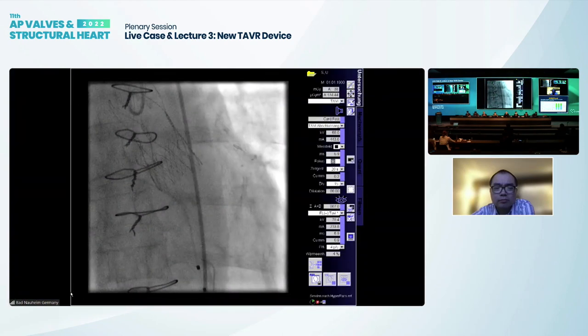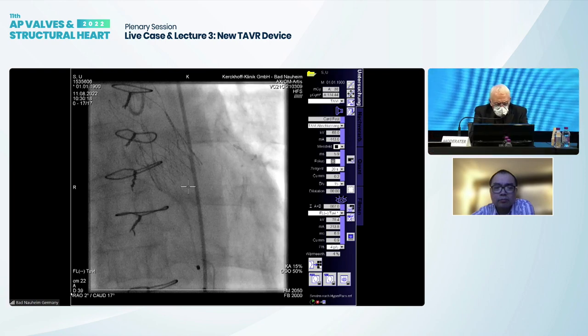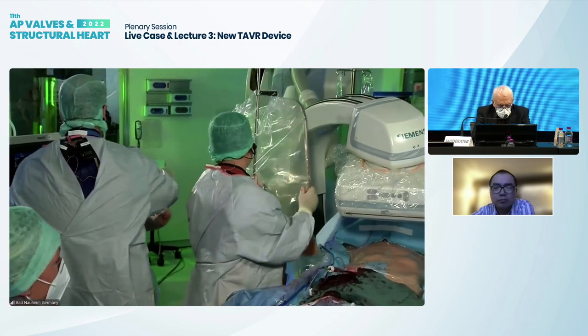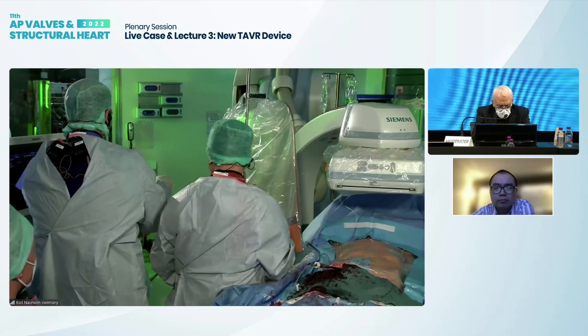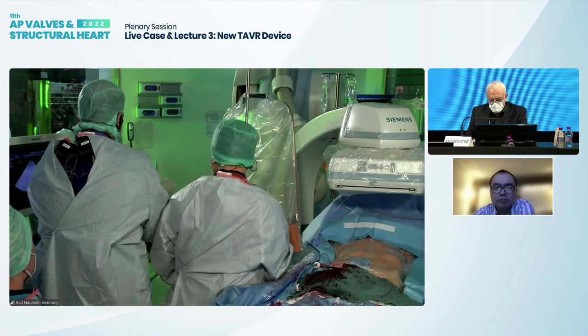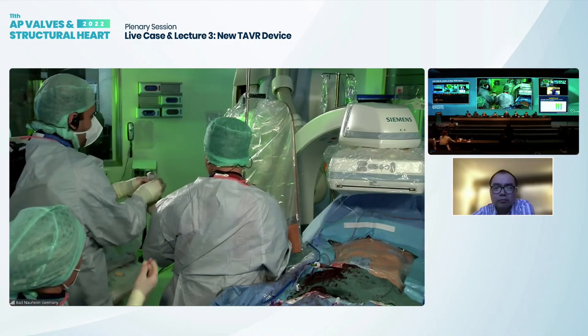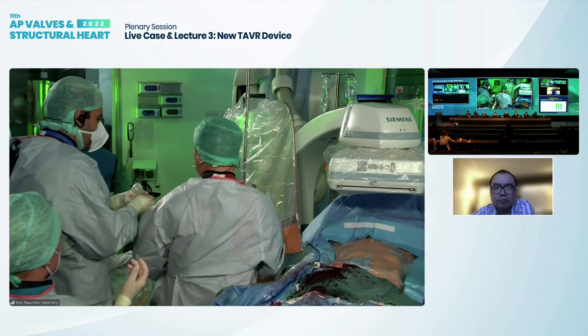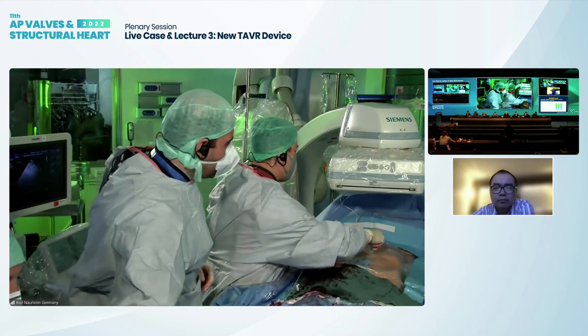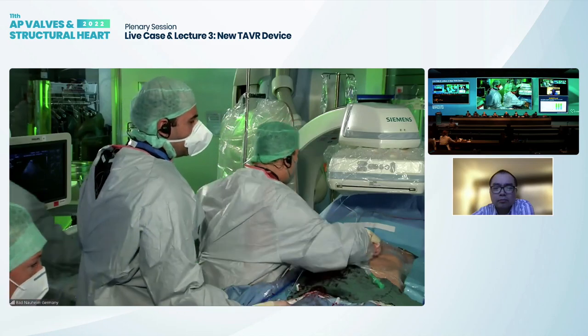But in case there is, you do a post-dilation, and hopefully that's going to take care of it, right? Yeah, exactly. But with this small amount of calcification, I'd be surprised to find any more than mild PV leaks. So I will check on echo, because sometimes, indeed, the pigtail catheter can cause artificial AR. I hope that we will have sufficient view, but this is our default approach.